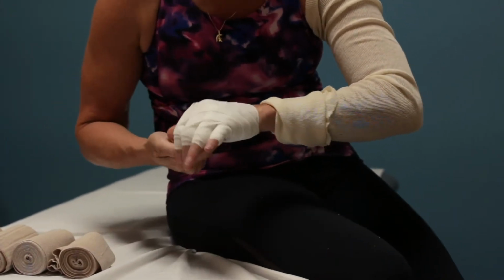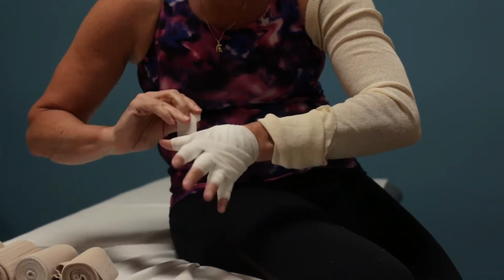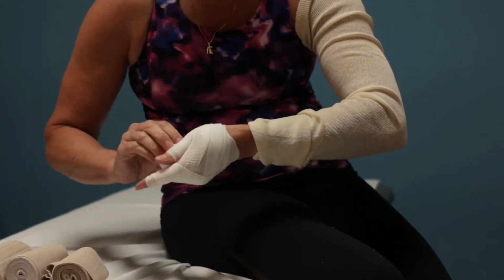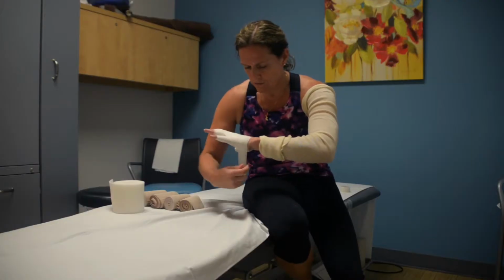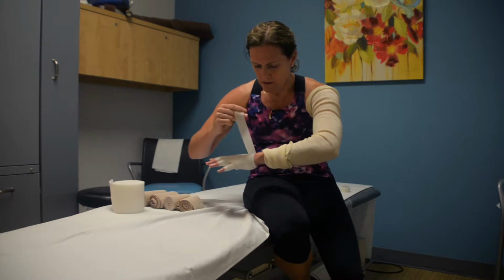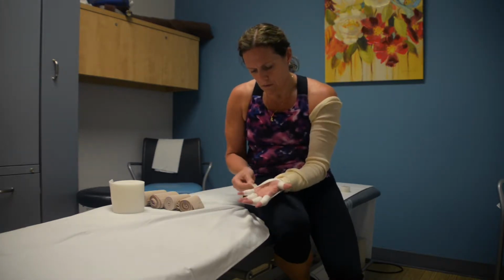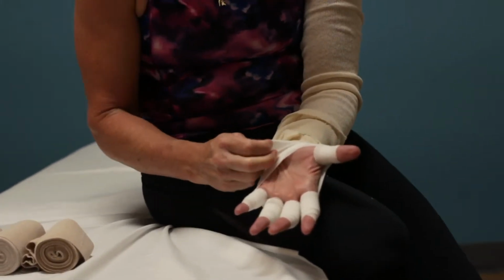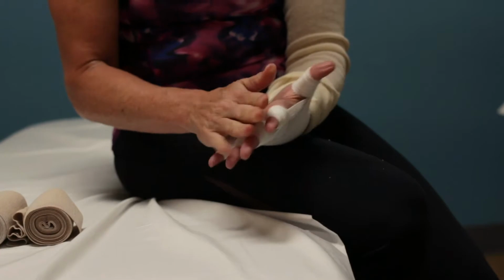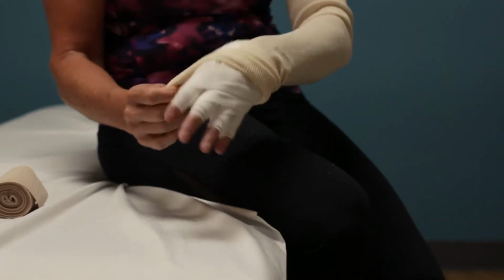I usually will go just twice around the thumb and twice around the pinky. So we have a little bit of finger bandage left over, and basically I just use this up. And then what's going to happen here is you're just going to tuck this finger bandage right into itself. And there's your finger.